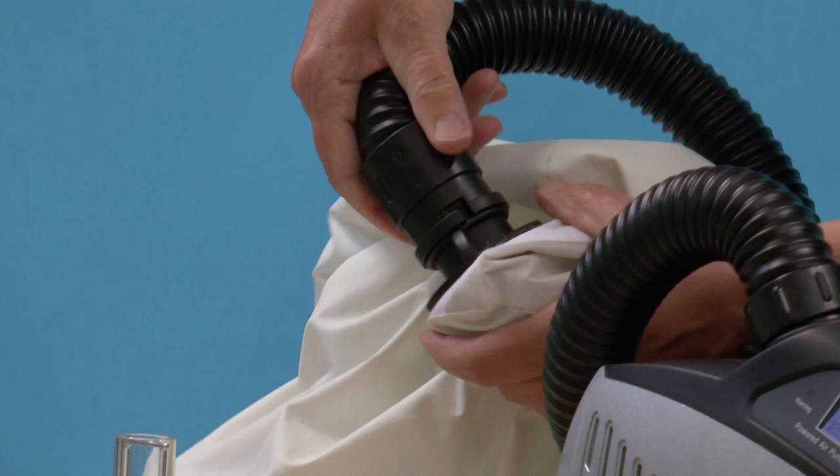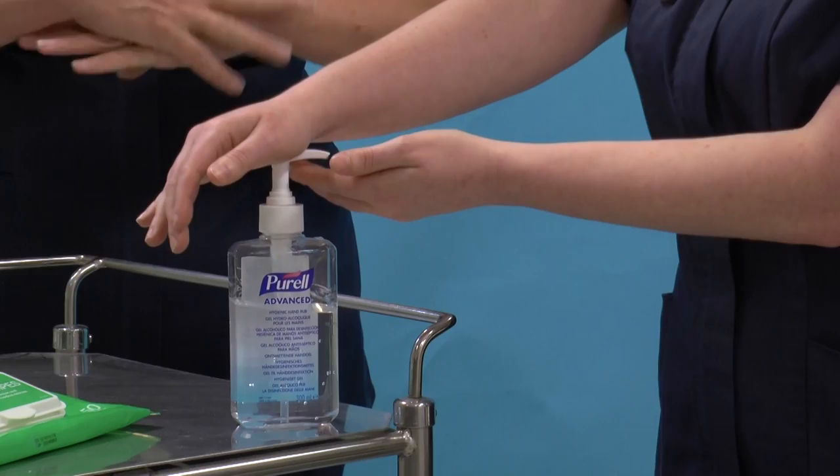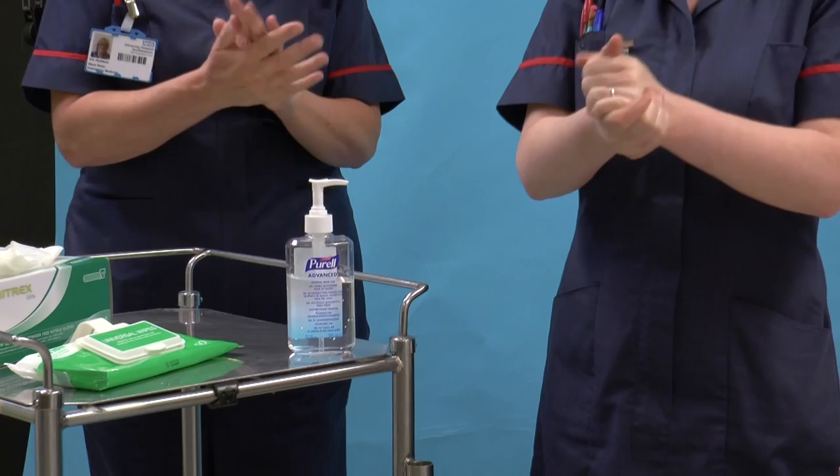Donning your Perso respirator and other PPE is a two-person procedure and must be done with a buddy. Before you begin, make sure you are well hydrated and don't forget to go to the toilet if you need to. Ensure your hair is tied back. Both yourself and your buddy then clean your hands using alcohol hand rub. Turn the respirator on and check the flow rate is 170 litres per minute.